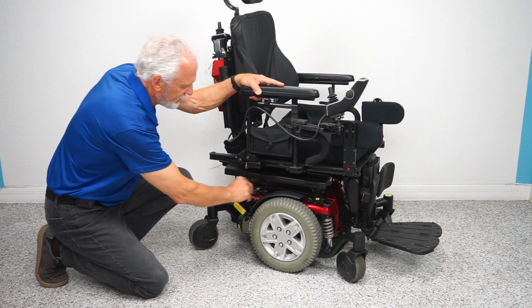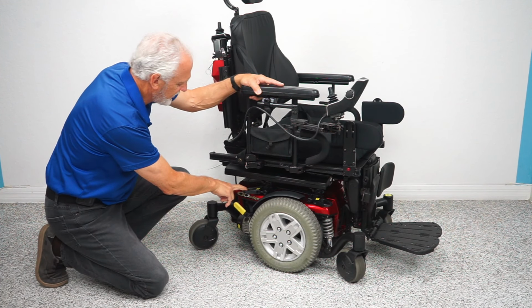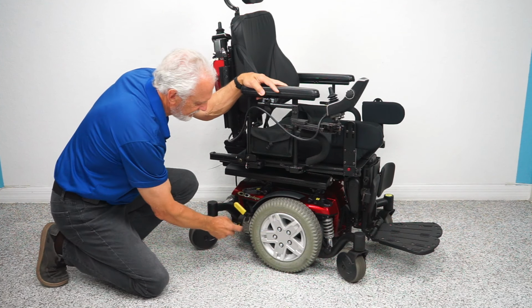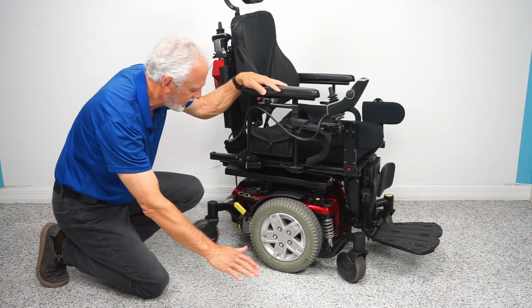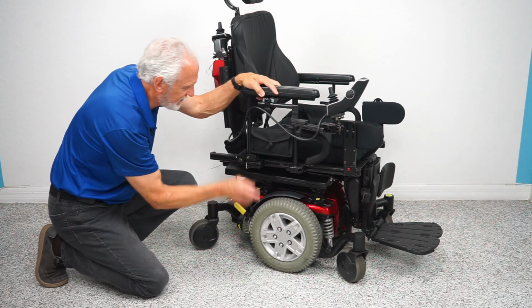You have anchor points here and here. You have 2 on this side, 2 on the opposite side. This is where you secure your chair if you're going to transport it. This motor here goes to this wheel. This motor is directly connected to the wheel. There's no chain, no belt. It's all directly connected. That's why there's no maintenance. You have one for each side.